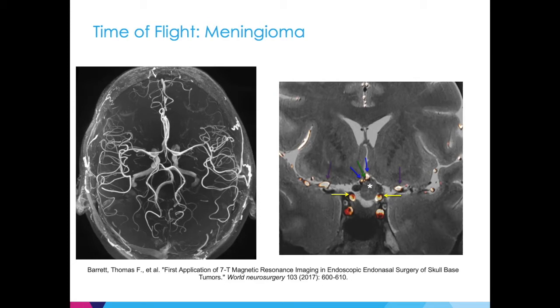And this actually is very useful for planning and also for guidance in the operating room. Some of the decisions that are made use many different factors. They synthesize a lot of information. And I had the opportunity to observe one of these surgeries, and the decision-making process is greatly enhanced by having some information of the relative location of these structures geometrically to each other.